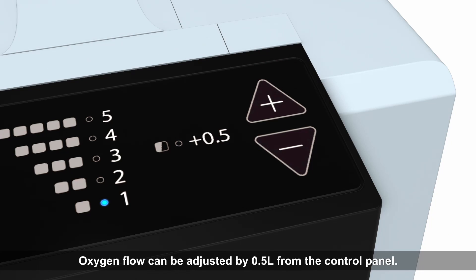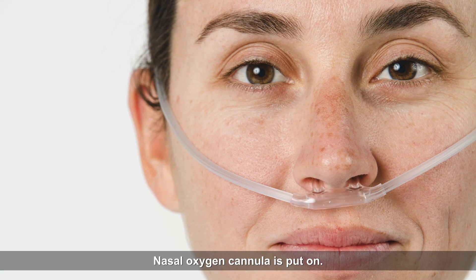Oxygen flow can be adjusted by half a liter from the control panel. The nasal oxygen cannula is then put on.